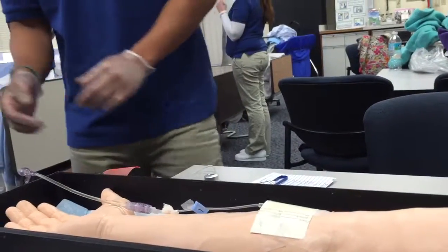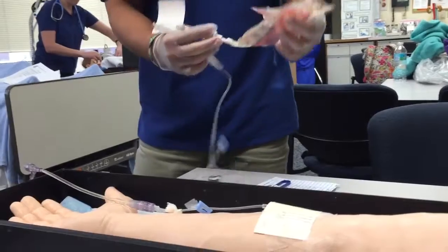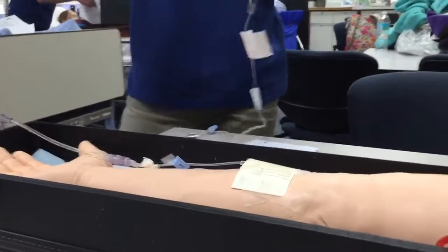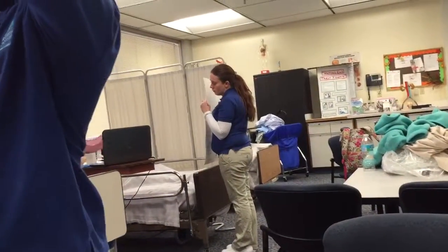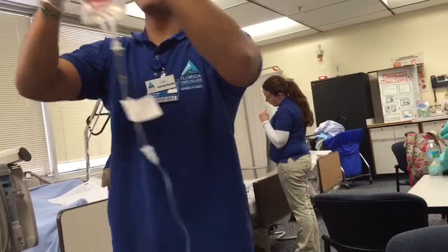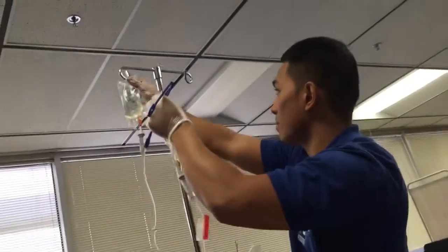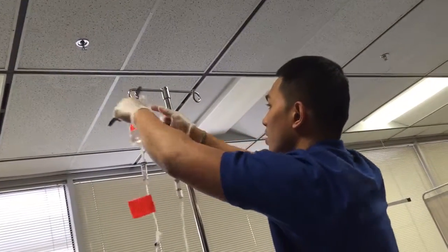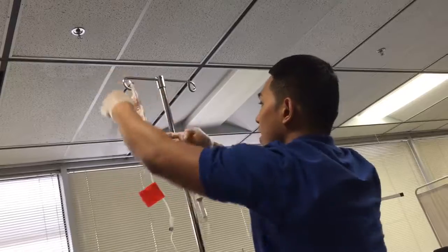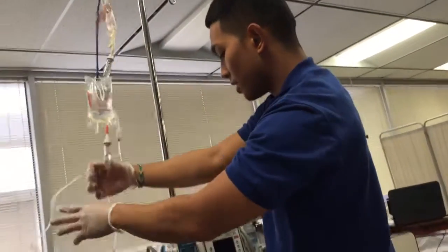It's running right now. So in order to run the piggyback, I'm gonna go ahead and connect this tubing right here to here. And then I'm going to drop the primary. Actually, I did it backwards. So I'm going to clamp the site to close it. I'm going to go ahead and move this back, hang the piggyback higher. I'm going to go ahead and put that there and hang the primary line lower, just like that. And this is not connected yet.